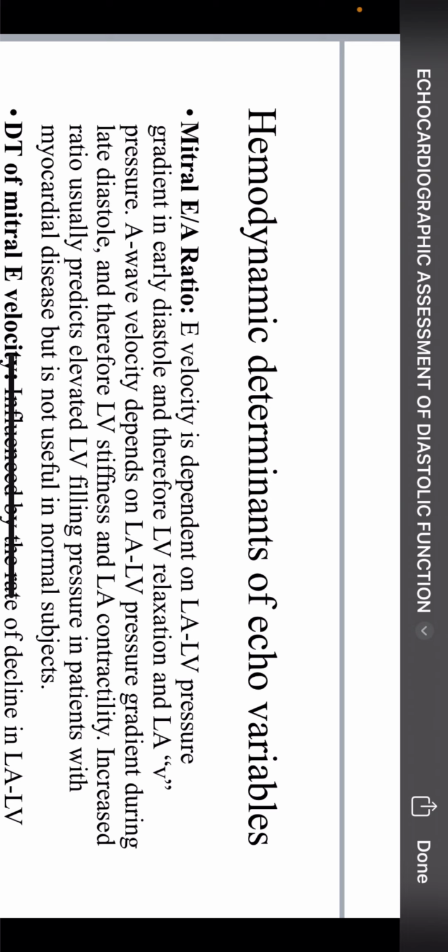Now, in conditions where the atria cannot contract, for example atrial fibrillation, the contractile function of the atrium is lost. So will the A wave be there? No. Because contraction increases the LA pressure, and that's when it can exceed the LV pressure to force the 30% of blood into the LV. If atrial fibrillation is there, it cannot. Or if the LA is enlarged, it cannot.